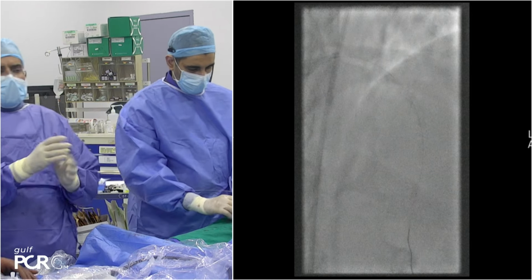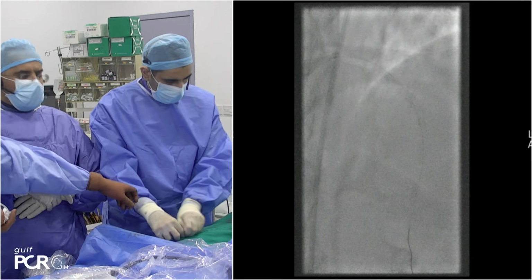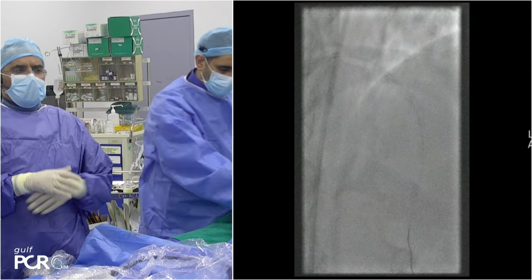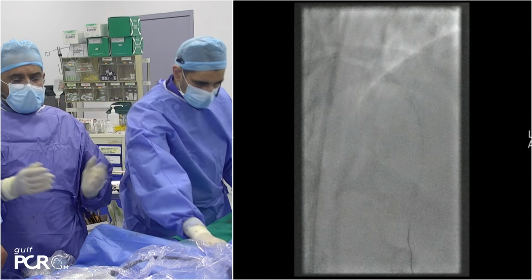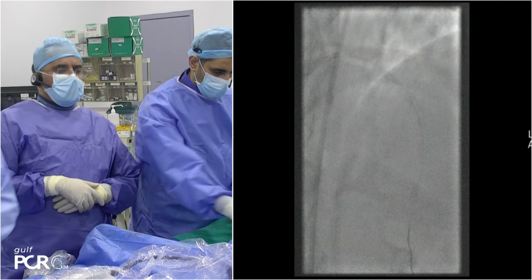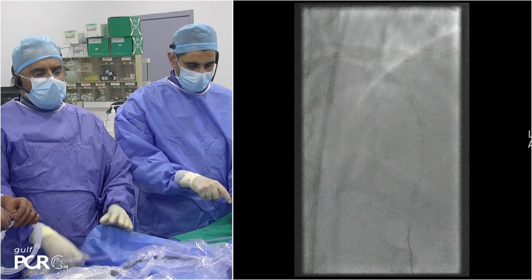I think given the nature of the LAD, this is a good result. Given the amount of calcium and the diffuse disease, you don't want to go really distal. And just remember that the surgeons told him, well, you have bad vessels, we have no solution for you. Right now his proximal to mid LAD is open. Nitro, give me nitro.